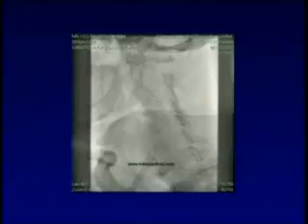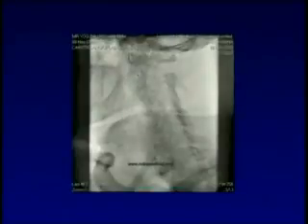Then we used a Spider filter because it had the lowest crossing profile, and it allowed the use of coronary wires, which are the most gentle wires in our hand. And it has the lowest incidence of spasm, and the pore size was 100 microns, although we have better filters in terms of pore sizes. So then we passed a Spider device, and we opened the filter. This is the open filter beyond the aneurysm and the thrombus.